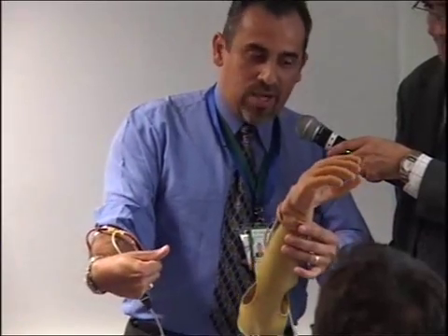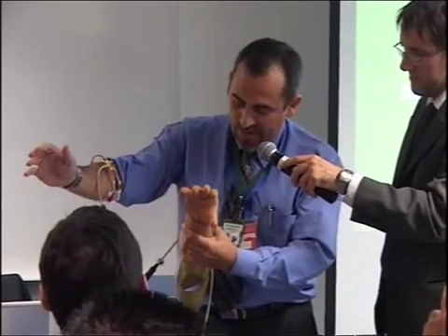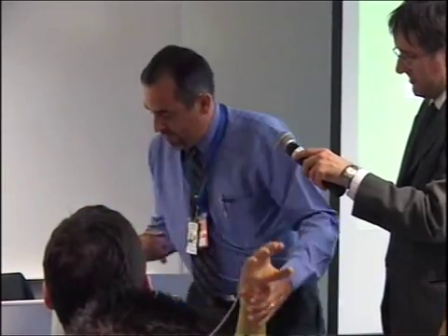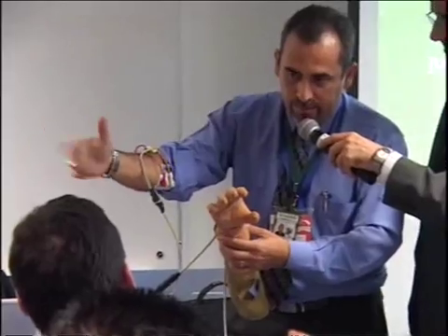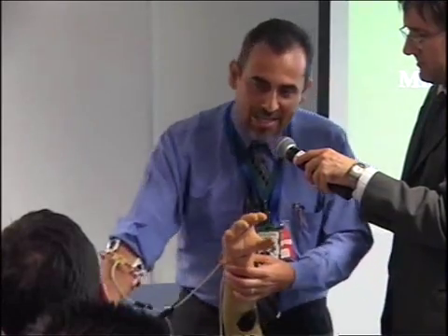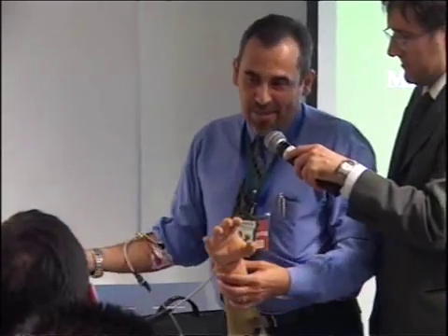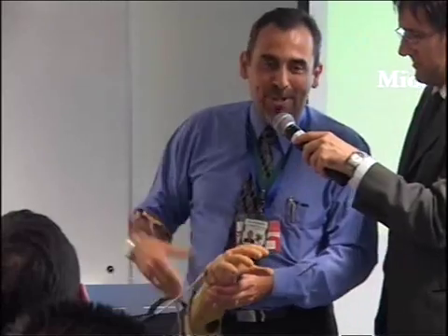Of course, I'm tired. My arm is tired. I've been transporting suitcases, etc. But let's try to hold an object. Two basic functions: closing the hand, I close my hand, open the hand. Basic functions: gripping. So what do you need if you have a hand missing? I need to grasp an object, gripping of an object.